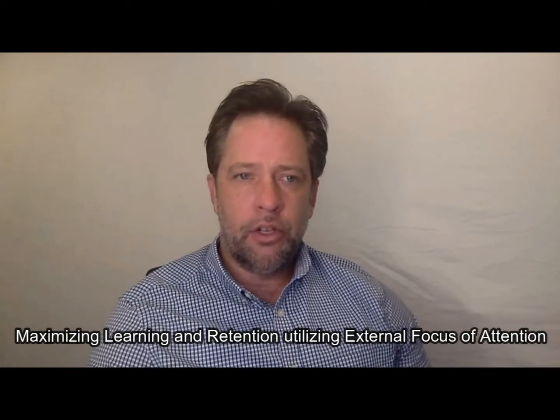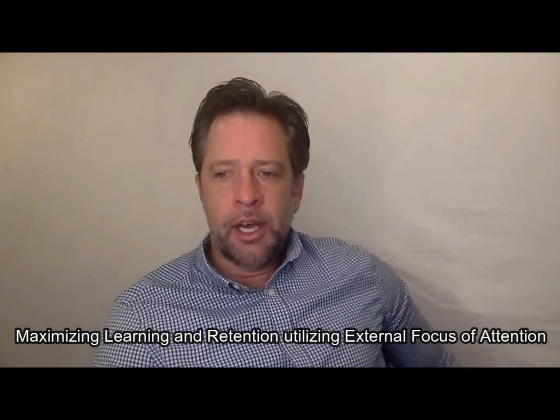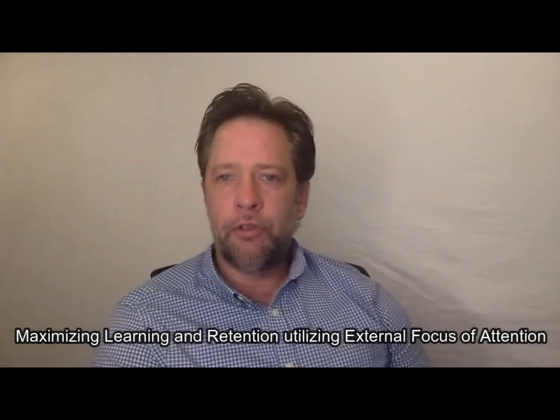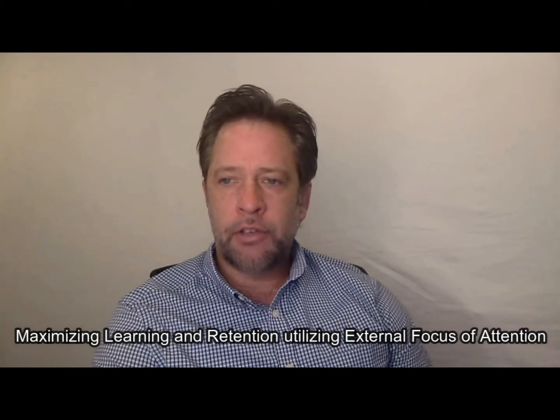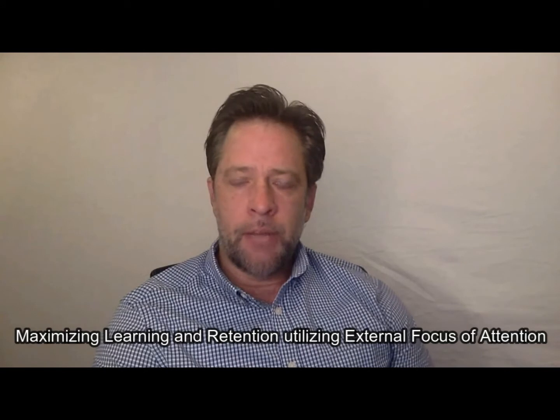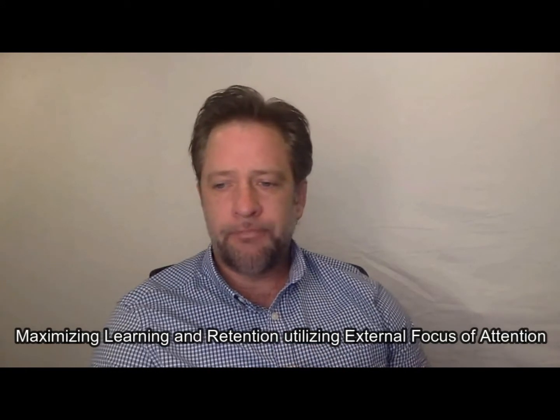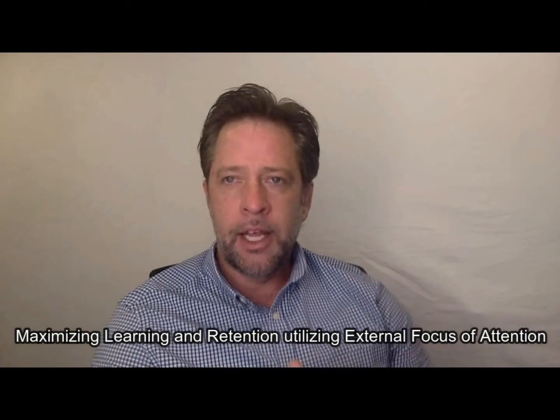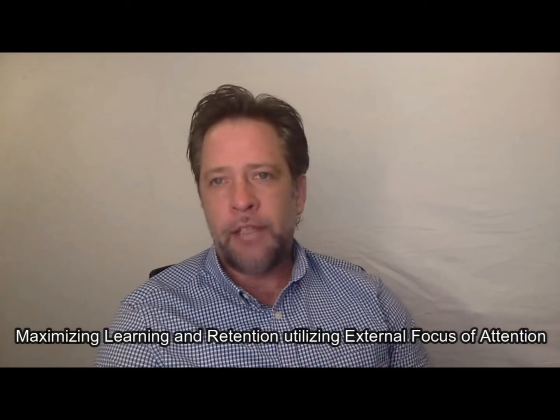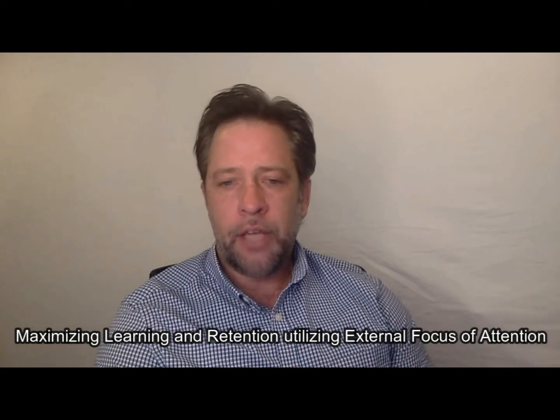While we are using the clinician kit to apply these concepts, the easiest low-hanging fruit that you can use is the laser as your external focus of attention. As we try to get the focus away from an internal focus of attention or cueing into an external one, things that are outside the body, the laser automatically provides that for your clients and for your patients.